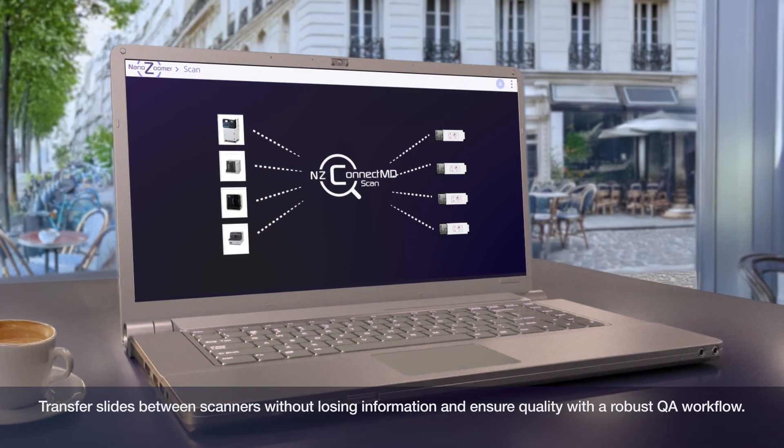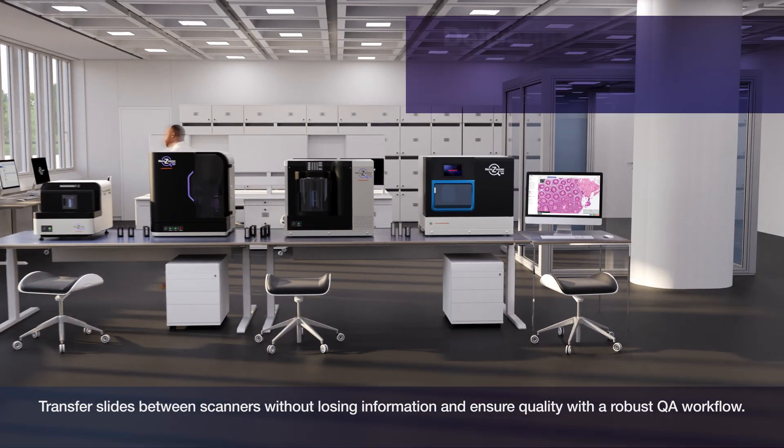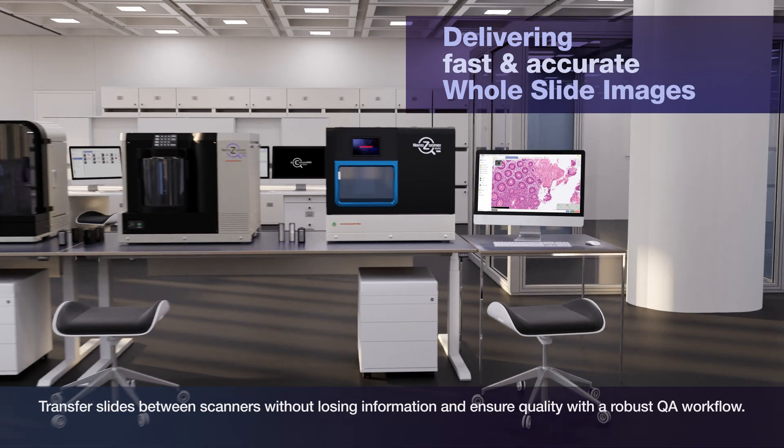Transfer slides between scanners without losing information, and ensure quality with a robust dual workflow.